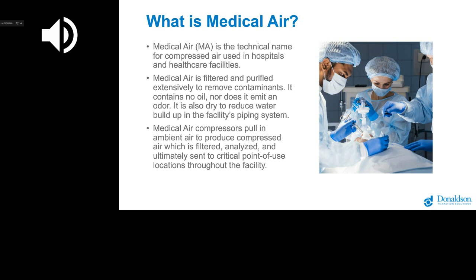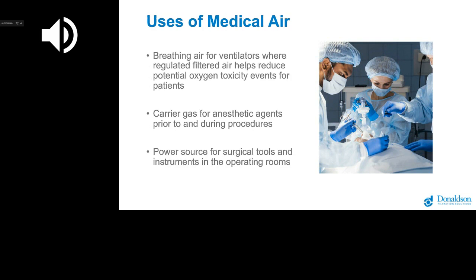Typically, what we see within applications is three main areas of uses. We're using the breathing air for ventilators, which have been very high profile over the last few months, particularly because of COVID-19. It can be used as a carrier gas also for anaesthetics before and during procedures, and also for surgical tools and instruments used in the operating theatres.